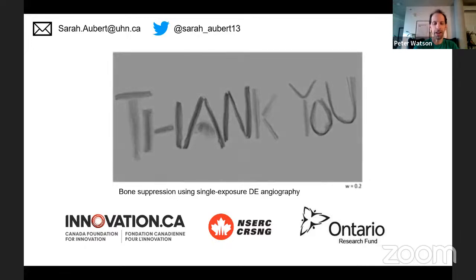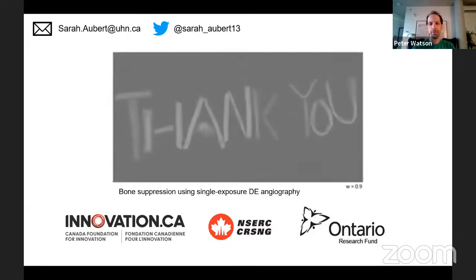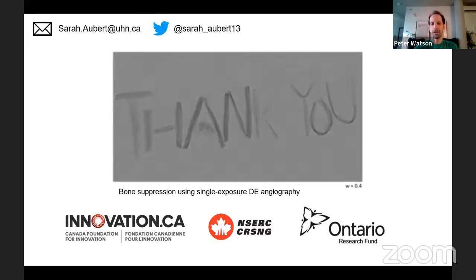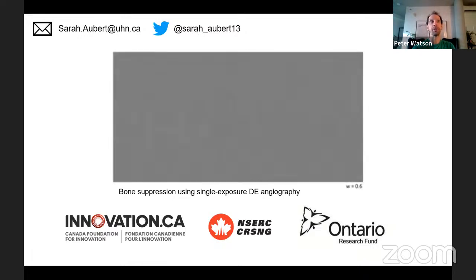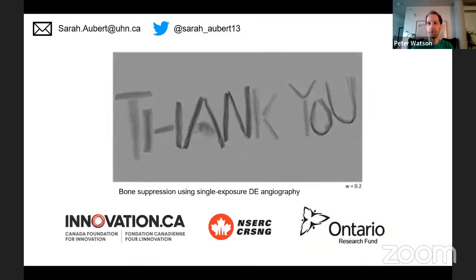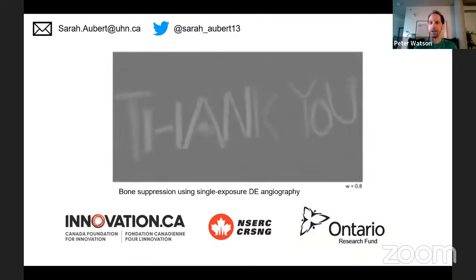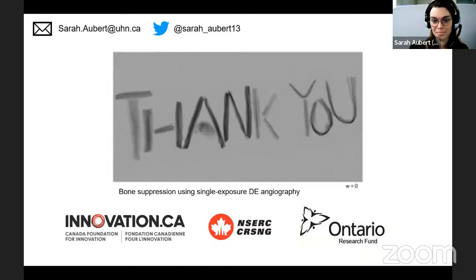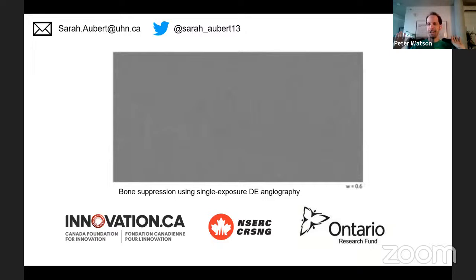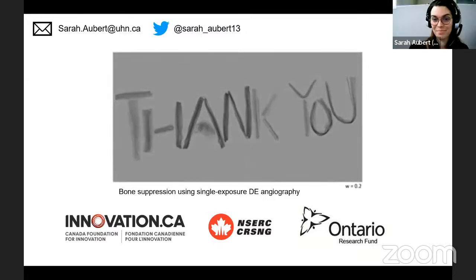Awesome. The ACNR correction. From how you described it, you're basically just using the correlations between the high frequency content of the images at higher and lower energies. Yep. And removing that. So you're basically saying all high frequency data is noise, get rid of it.